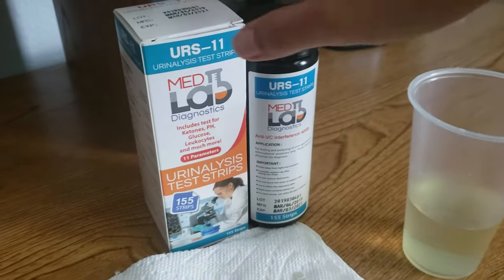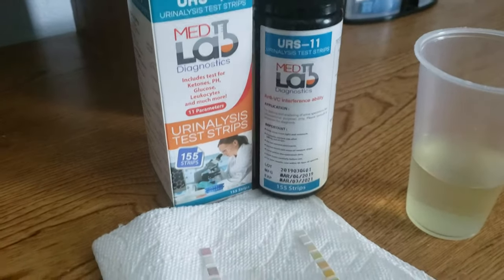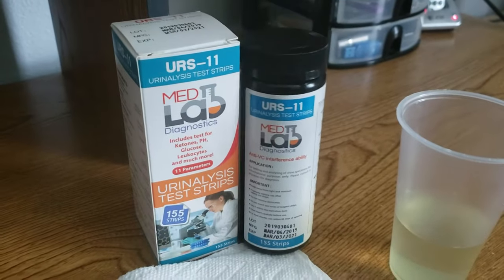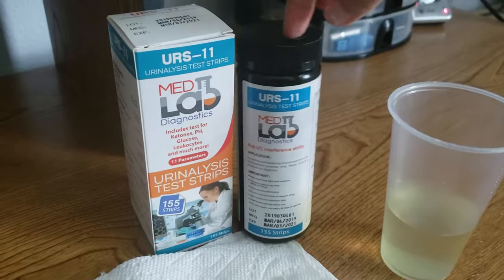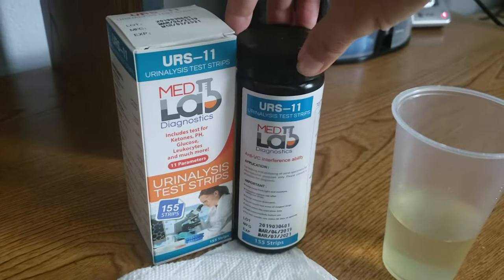Your urine test strips test for 11 different parameters. One of the first things I want to mention is that these test strips — any urine test strips, regardless of the brand — will start to go bad once you open the seal. They do start to deteriorate because they're sensitive to temperature and humidity.